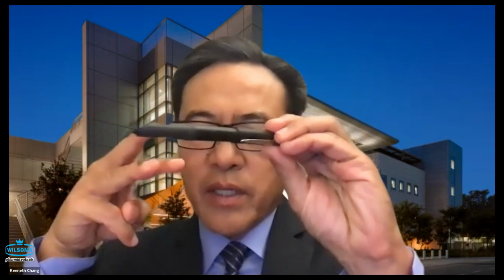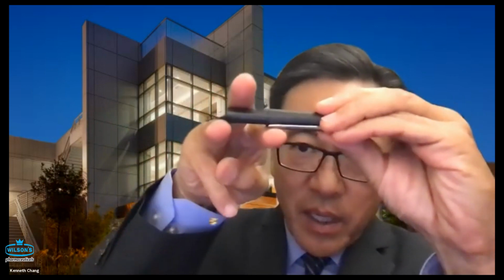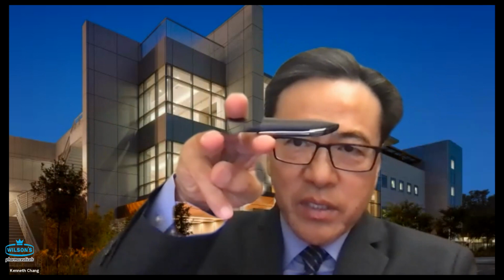And the reason why I do that more often is just from a hypothetical point of view. If there's a needle that has 3 sharp prongs, and if it comes across a blood vessel, those 3 sharp prongs will capture the vessel and cut it, and it'll actually slice it here and here. It can slice it in 2 places, and I'm just afraid that if I run it across a significant vessel and cut it in 2 places, that bleed may not be stoppable even with my techniques. That's purely hypothetical, but I have heard anecdotal cases of really severe bleeds with that needle.